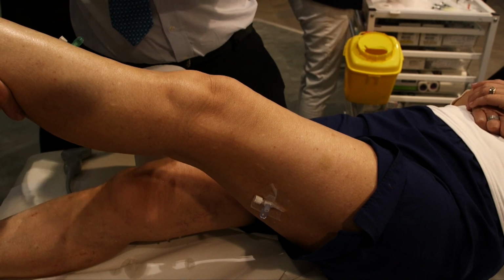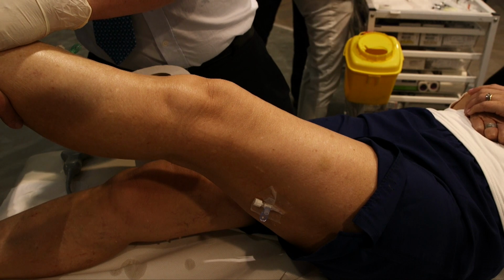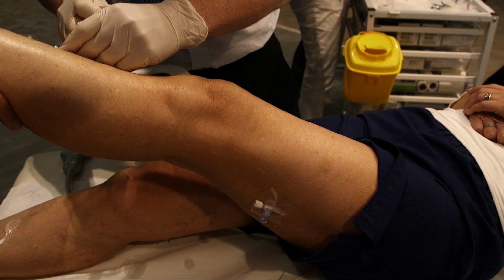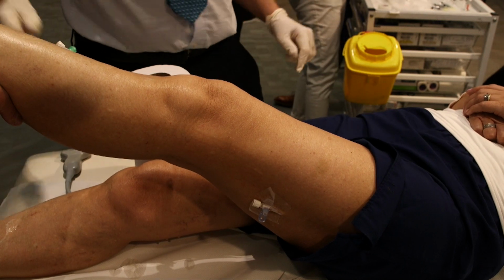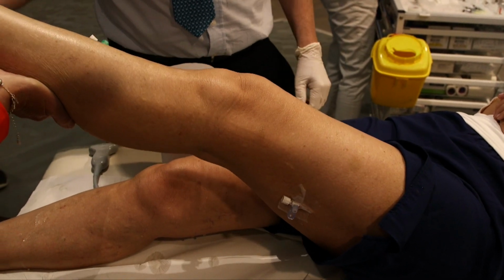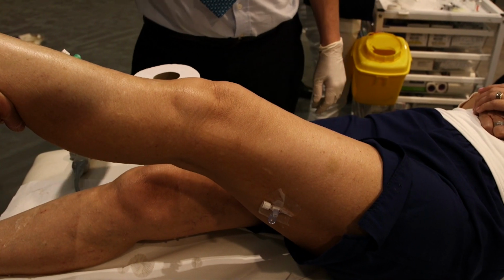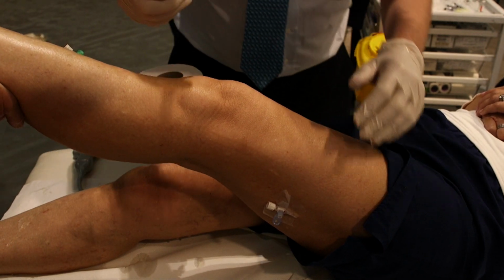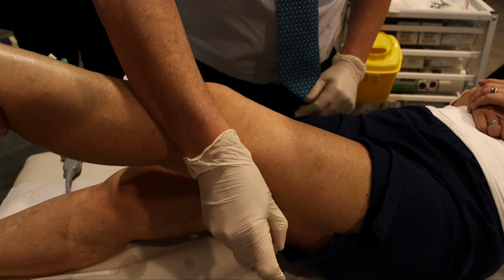So a little bit of foam drifting in here. Put a little bit in down here. Don't like putting too much in at the ankle. Most of it's supposed to go in the patient, not on the patient. Doesn't work so well applied topically. So that is 5 mils in there. If you waggle this foot up and down like this. You didn't come here for a rest, I think. And you can relax. So this manoeuvre is intended to encourage the flow in the deep veins and discourage the development of deep vein thrombosis. I'll go for 3 next, please. This is some more 0.5% STS foam. I'm going to put that in the perforating vein laterally.